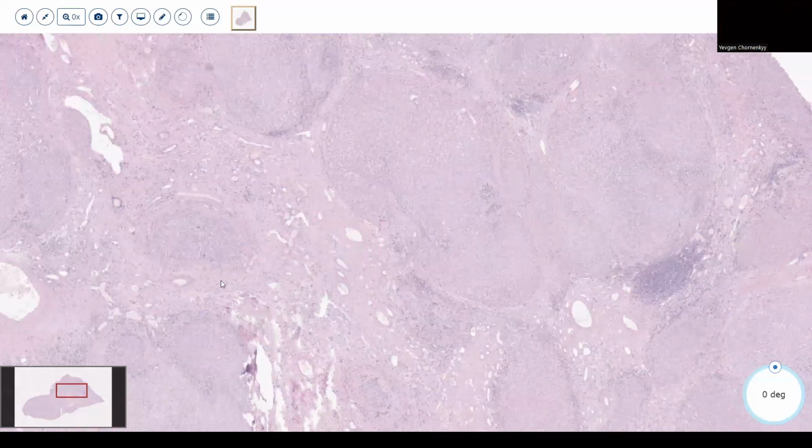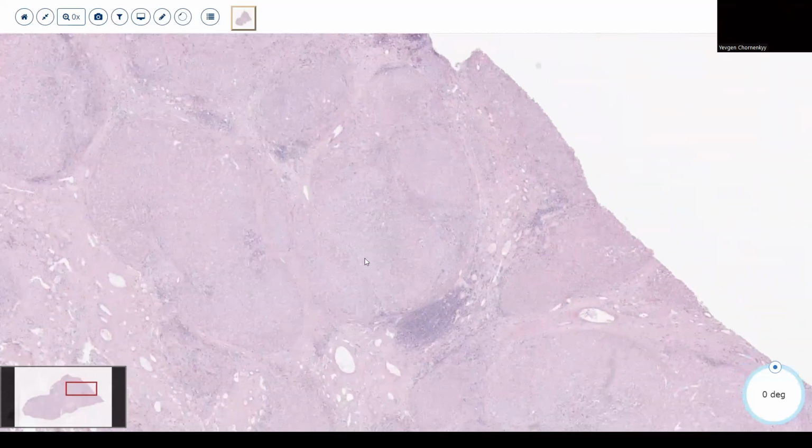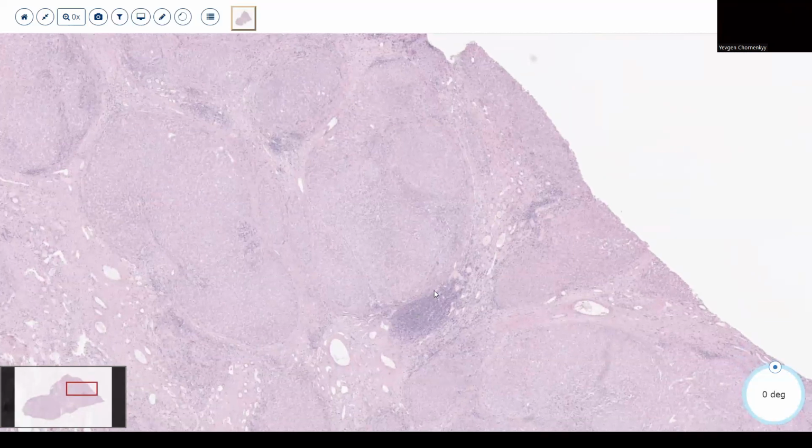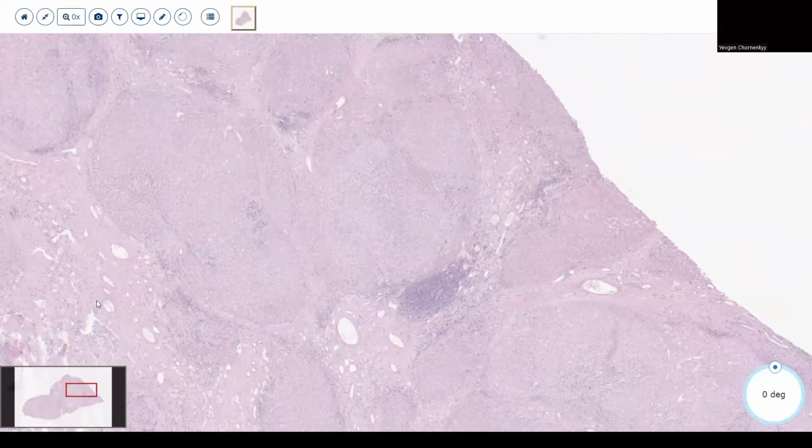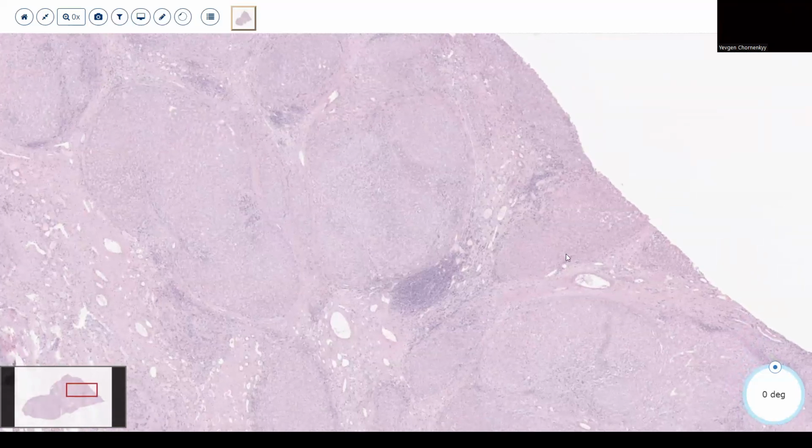So the differential here, we have lymphocytic aggregation, we have nodular architecture, and we have a lot of large unpaired arteries. So things I was hoping you guys would think about would be adenoma or FNH. Maybe cirrhosis, but I'm not sure if I gave you that option.